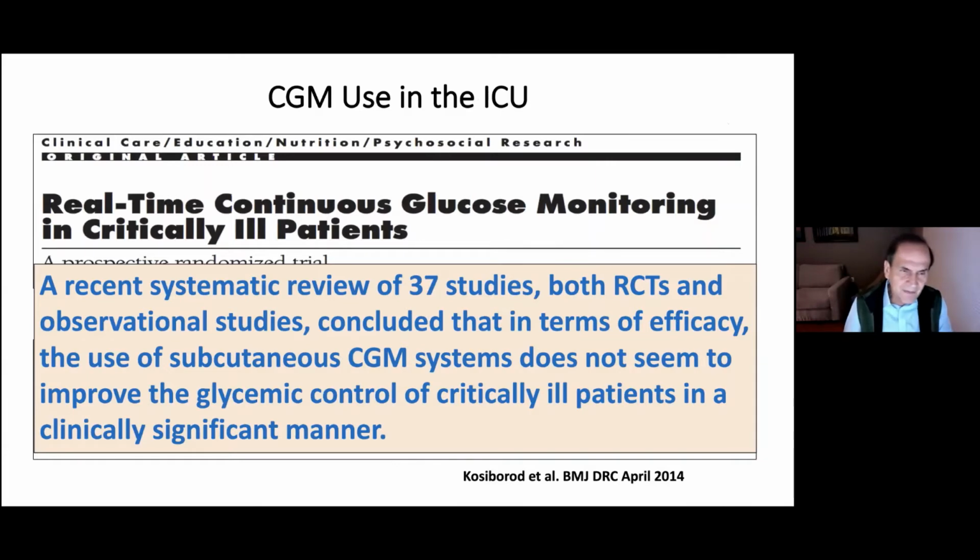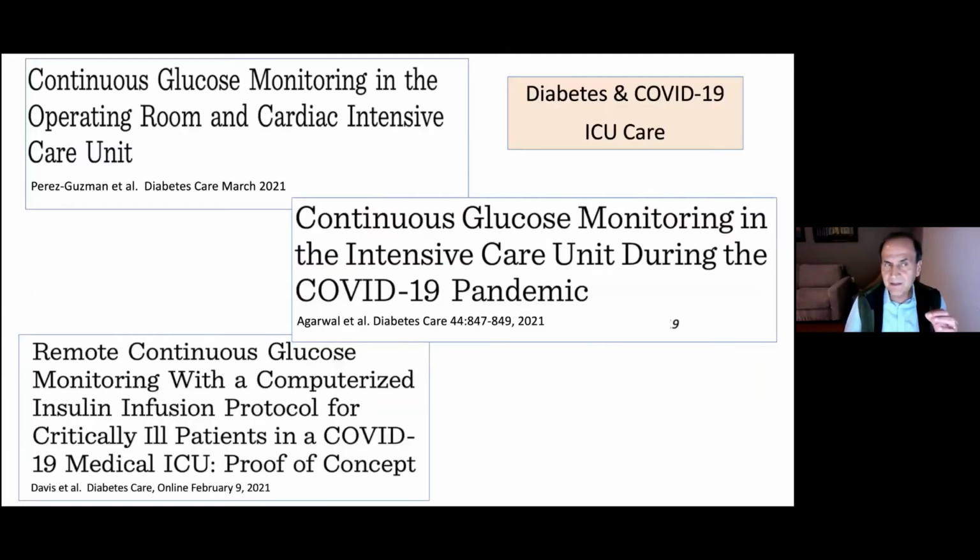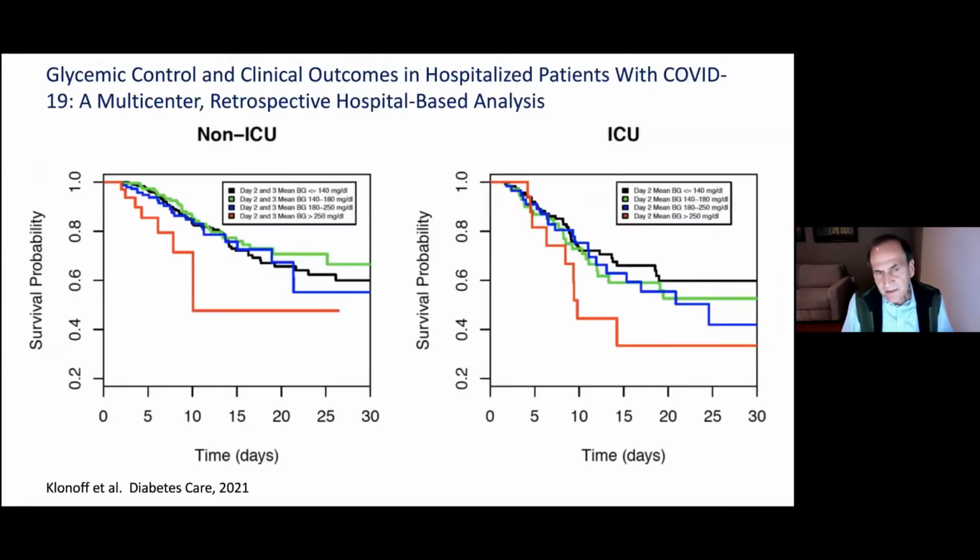So for many years, we have had the CGM that has not made a great impact, until recently, when COVID made its appearance. And during the past year, there have been several studies from our group and others using CGM with remote continuous glucose monitoring to reduce the use of PPE and decrease the exposure of house staff. And of course, there is such an importance, and this is data we just published a couple months ago, in over 1,000 patients, to determine that in COVID patients, those who have hyperglycemia greater than 250, in red, have significantly worse outcome and mortality compared to those who have better glucose control. Even those patients with or without diabetes, with a glucose greater than 250 in the ICU and non-ICU, is associated with a 2 to 5-fold increase in mortality.